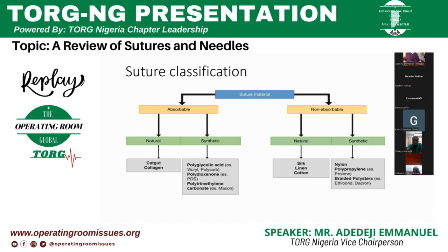And then the non-absorbable as well, we have the naturally occurring and the synthetic. Under the synthetic, I'll just quickly move to the synthetic, which of course is more or less in practice these days. I don't have everything on the slide, but please pay attention, and this is also recorded. There is a particular text that I'm using that I'll forward to the group after this presentation.